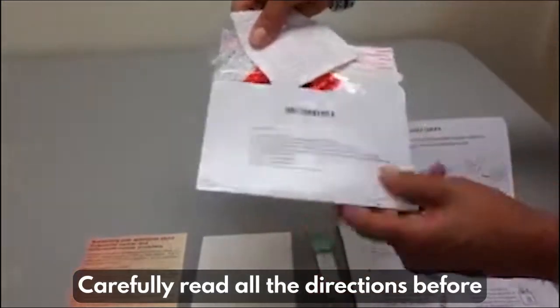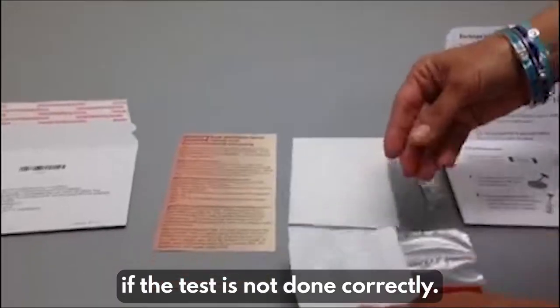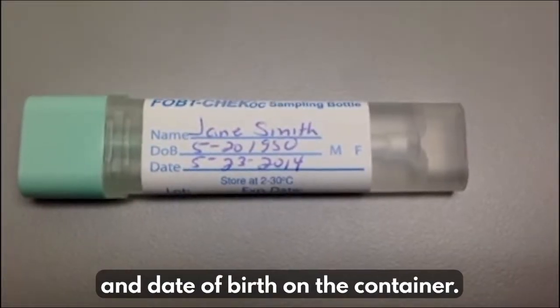Carefully read all the directions before you start. The test results may be invalid if the test is not done correctly. If there is no label on the container, use a ballpoint pen to write your name and date of birth on the container.